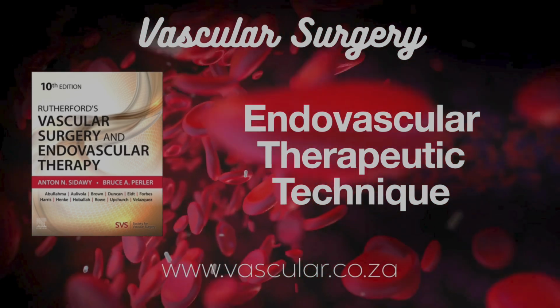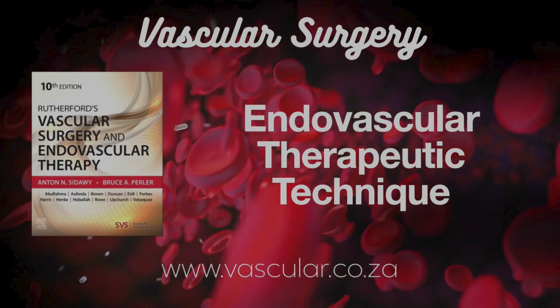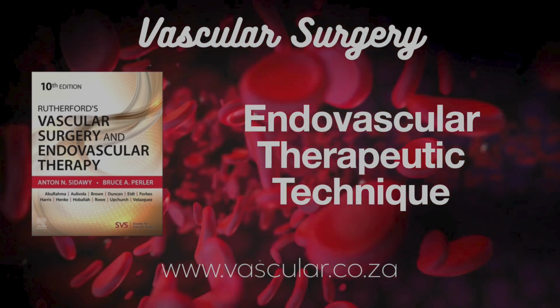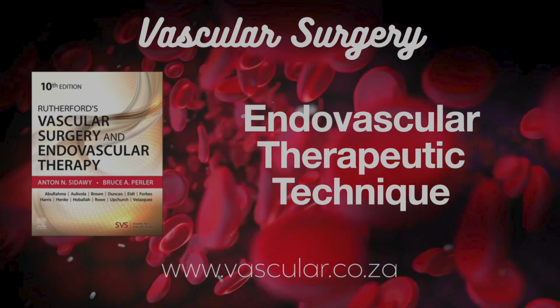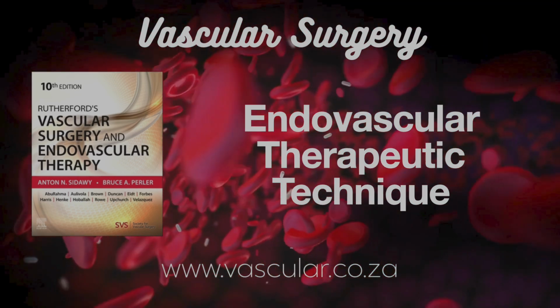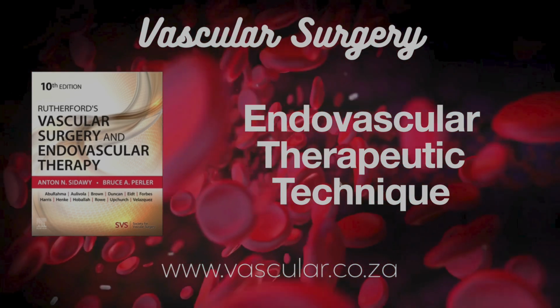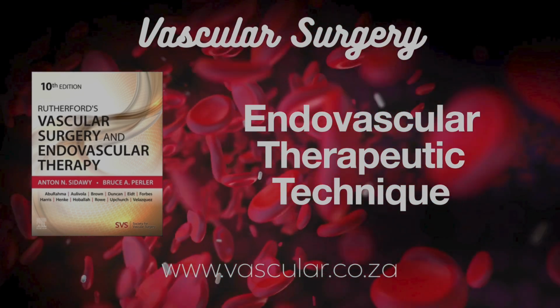Covered stents? Sounds like a stent plus a graft layer. That's exactly what they are. A stent frame, which could be balloon expandable or self-expanding, covered with a synthetic graft material. PTFE is common, polyurethane, silicone. And the purpose of the covering? It provides structural support, like any stent, but also creates a barrier, useful for sealing off leaks, aneurysms, or just providing a smoother, maybe more blood-compatible inner surface.